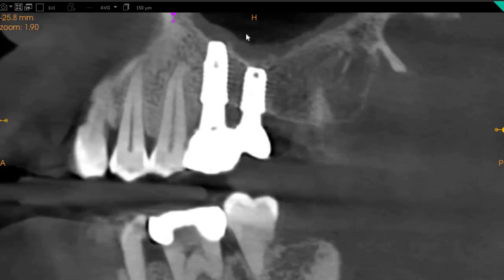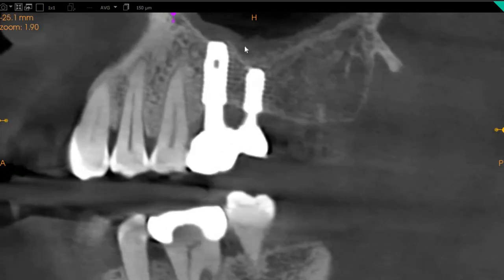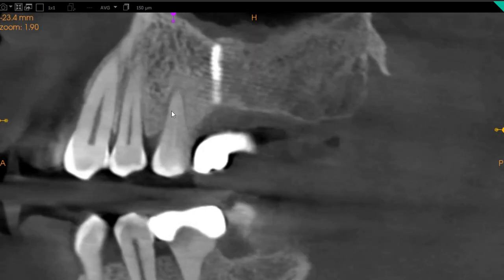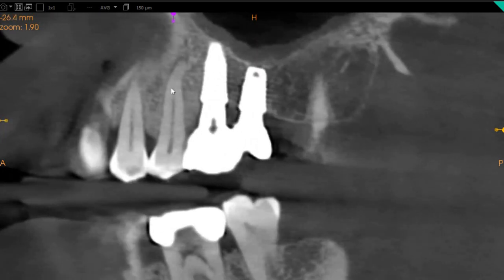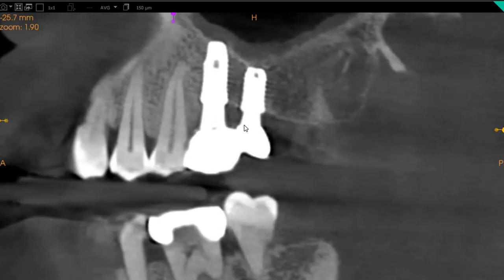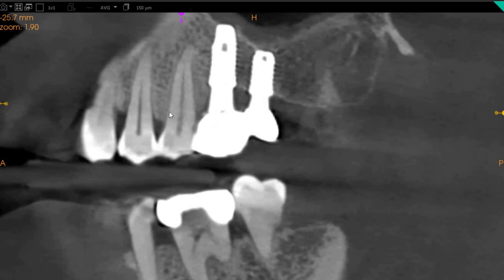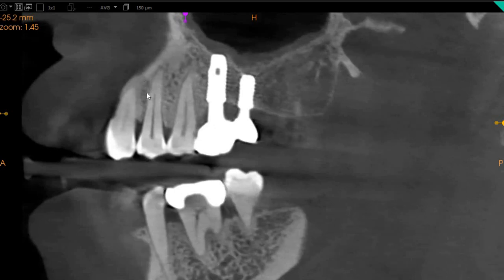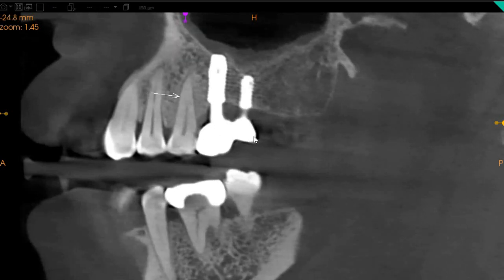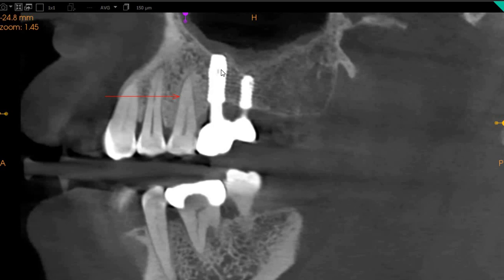The upper left five has this interesting line that is extending on one aspect, where we can actually see PDL widening. We can actually observe that there is a radiolucency which is slightly J-shaped in nature. We can see a slight line extending from this aspect.